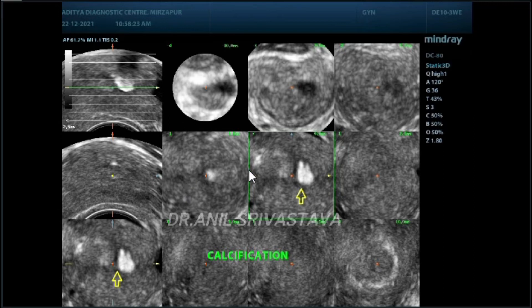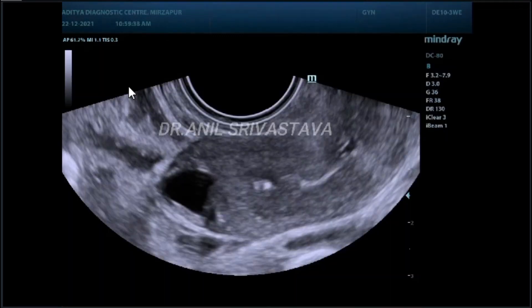This is a tomographic view. You can see this is a calcified lesion in the endometrial cavity.